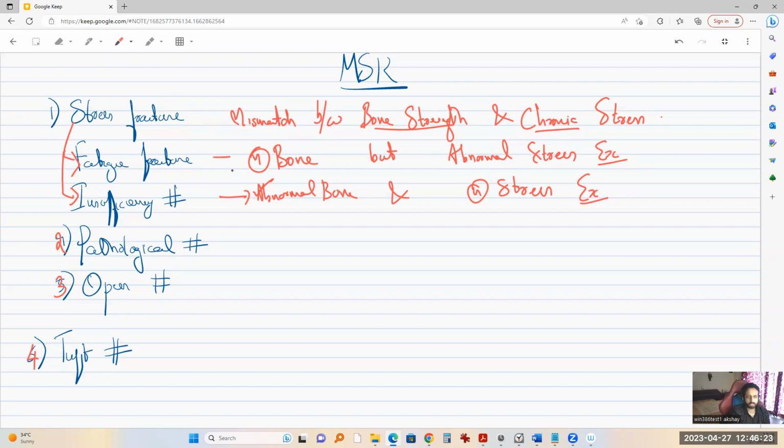Okay. And coming to pathological fracture, from the name itself, you know that it's a type of fracture that you see secondary to some sort of pathology of the bone. Most commonly, we see a lytic bone lesion.